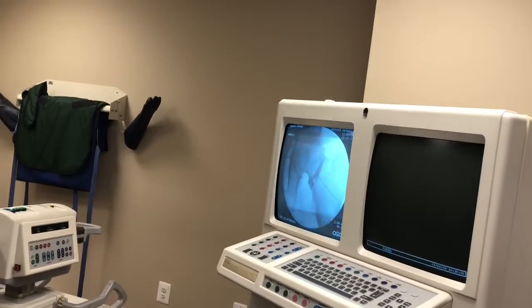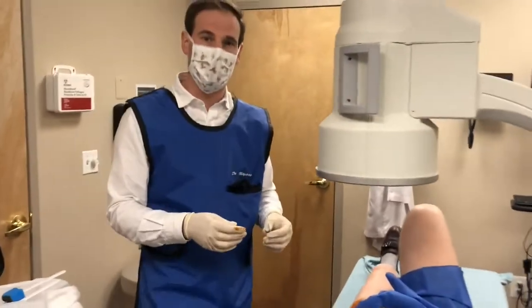Right there is perfect — you can see it sitting in the joint. And now we're finally ready to give a little bit of the medication.